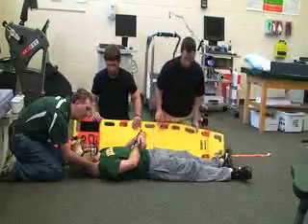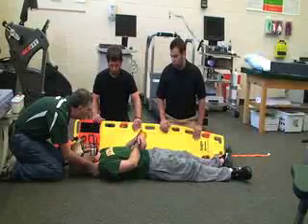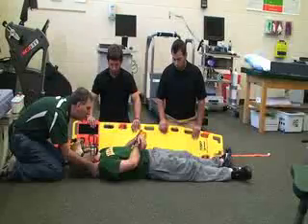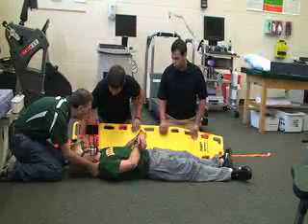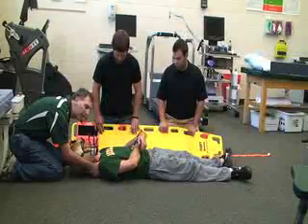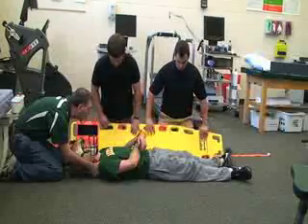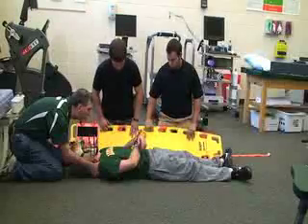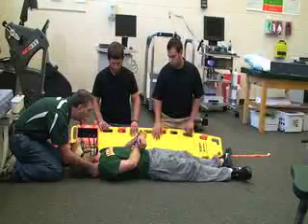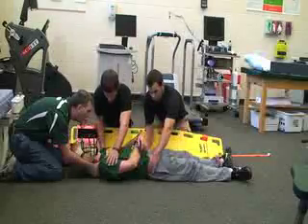You can also use a piece of string or tape to keep them together. Rescuer two is at the shoulders, rescuer three is down at the knees and hips. They've already unbuckled the straps and gotten those out of the way. They're putting the edge of the backboard closest to the victim, and they also have it at about a 45-degree angle. Now what we're going to do is roll the victim away from the backboard.